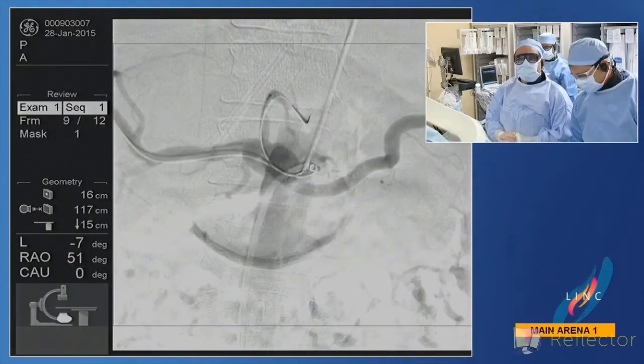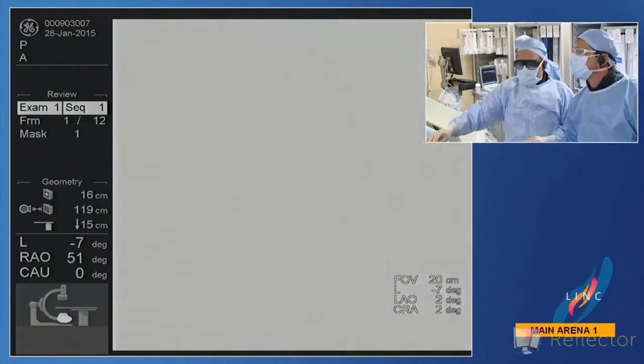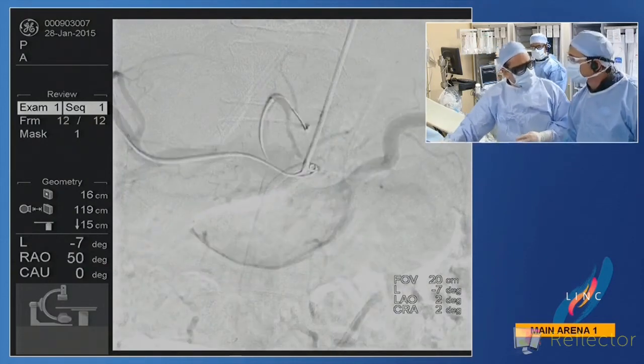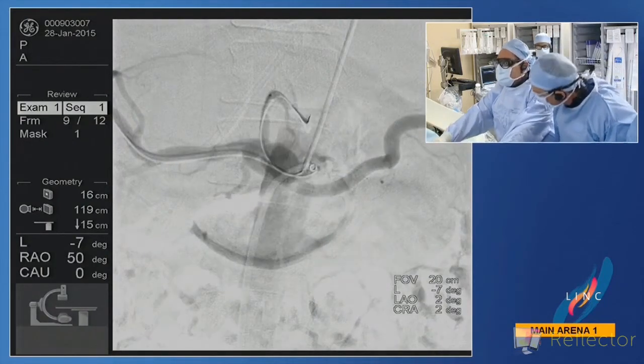Let me have, please, a 6 millimeter iCast. We can actually do it, because it's by 80, so we can get the short 6 by 22. A 622 iCast. All right, yep. Bert, 622 iCast, please.